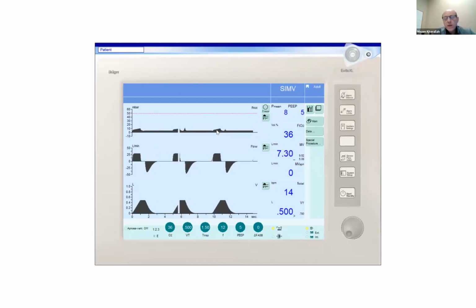So remember, the driving pressure is the tracheal pressure minus the intrathoracic pressure. So this is the transpulmonary pressure. The transpulmonary pressure is the true driving pressure. What you see on the ventilator, the difference between the plateau and the PEEP, is the driving pressure. But the true driving pressure is what the patient is doing at the same time. It's the tracheal pressure minus the intrathoracic pressure.